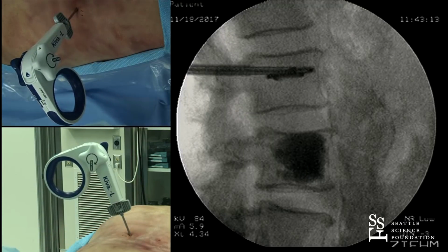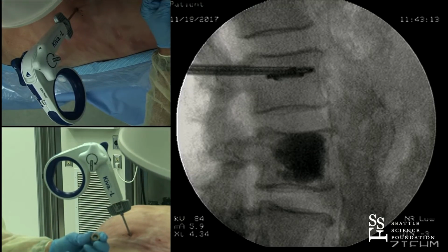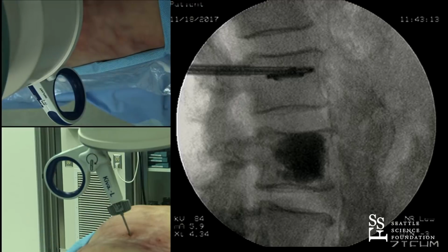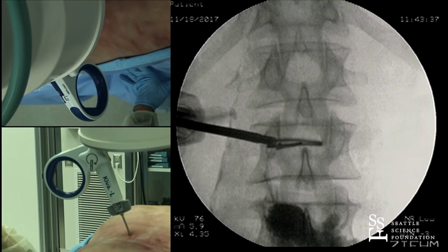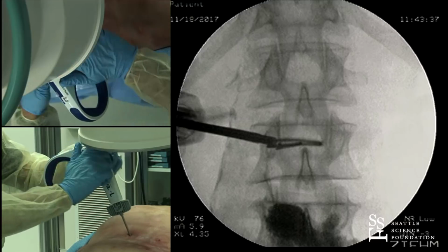What we'll do is we'll turn the coil back in, and the PEAK device is designed to be completely deployed, and it has little notches in it. So if you can just get a coil or two in, a sufficient amount is about that. One coil is sufficient to make a biomechanical difference. And so we will advance this out as much as we can, and I will pull the coil back.